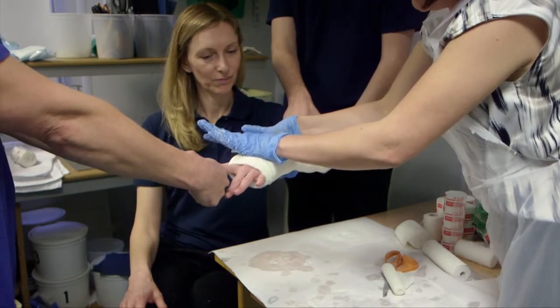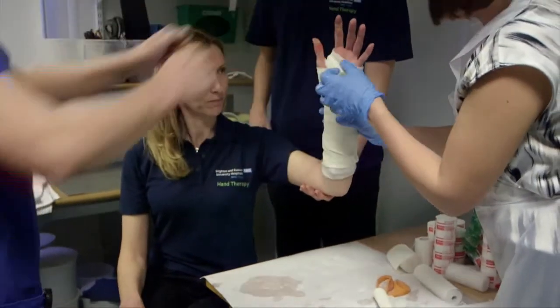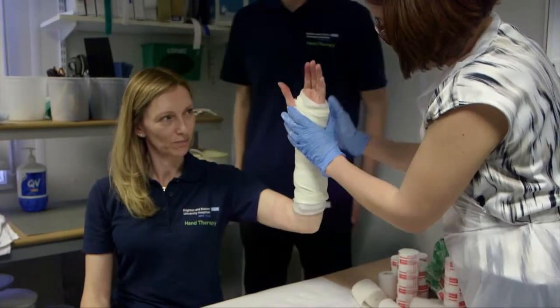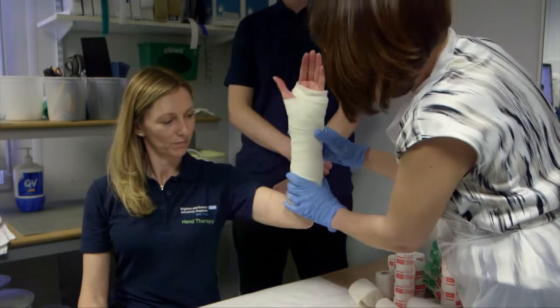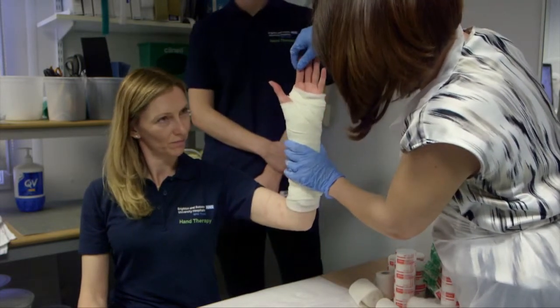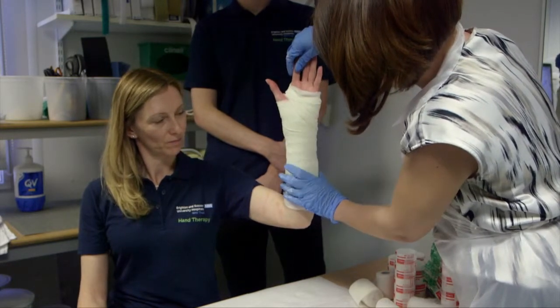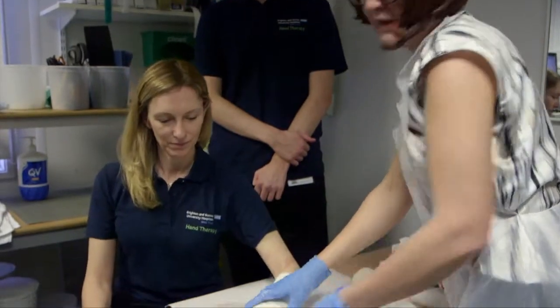Once the plaster is set, you can see here free movement of the fingers and thumb, neutral alignment of the wrist, and there's a very slight radial deviation which occurs when you traction the index and thumb, but it doesn't need to be overtly to the side. And that's a simple distal radius back slab.